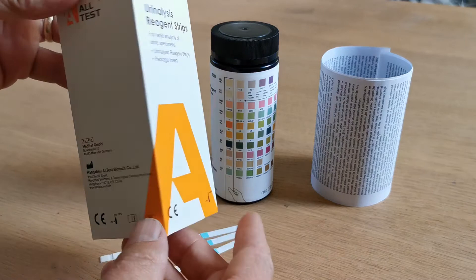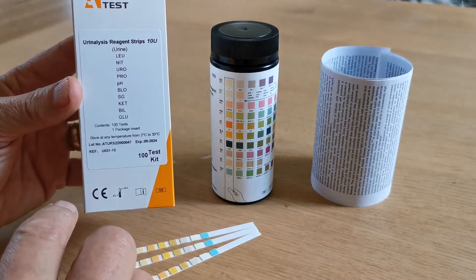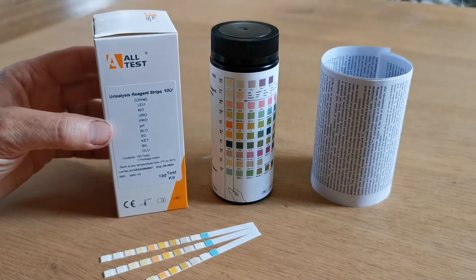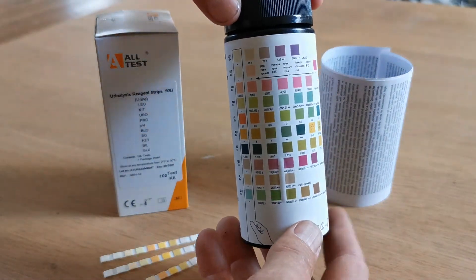The packaging is the standard AllTest box carton. 10U is the product code for this 10 parameter urine test strip, and the parameters that are included on the test strip are listed on the side of the box. The vial that comes contains 100 test strips.